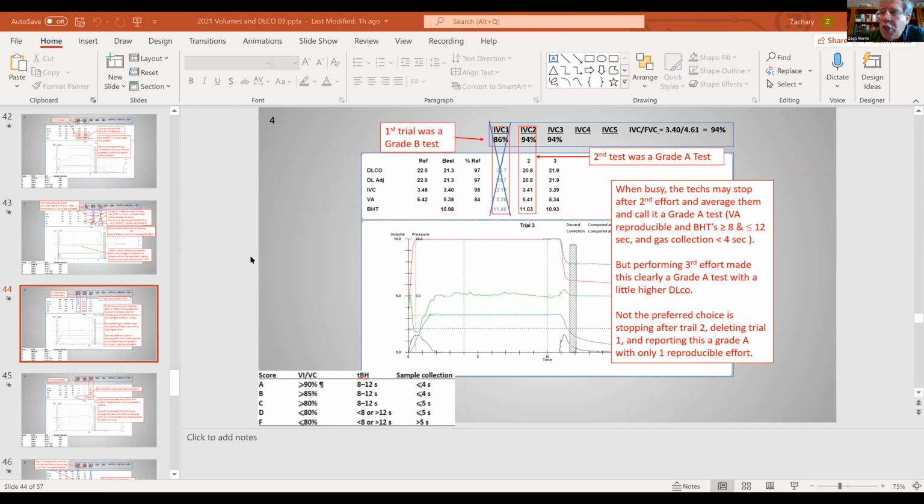I should have written that in a year or two ago, but the reason I didn't, to correct for the limitations of the current software, is because we were getting new software at that point. I didn't want to have to go back and rewrite all this code and do all the debugging and everything else. But little did I know it would be 2 years later and we'd still have the same junk going on. If this goes on much longer, I probably will be forced to actually do that to correct it. For now, just something to keep an eye on. You're not going to see it very often. It's pretty rare, but just keep an eye out for it.